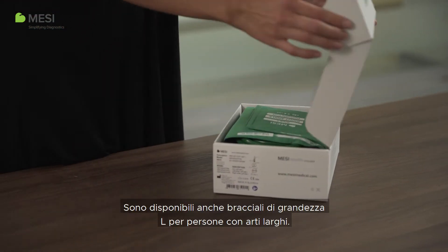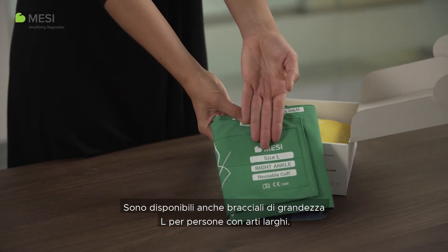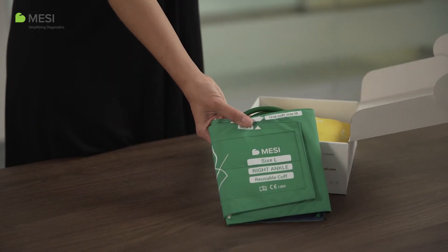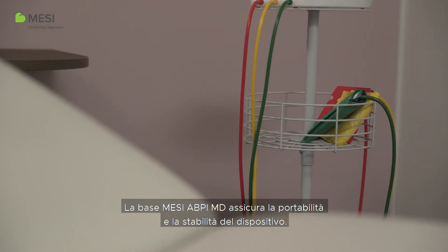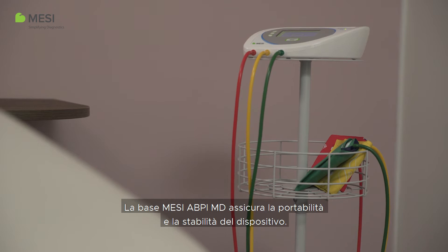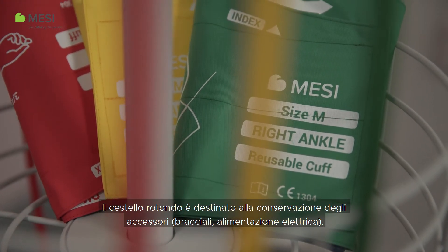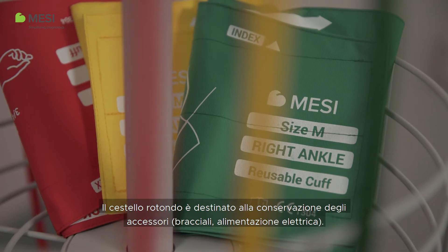Large size cuffs are also available for individuals with larger extremities. The Macy ABPI-MD stand ensures the mobility and stability of the device. The round basket is intended for the storage of accessories, like the cuffs or AC/DC power supply.